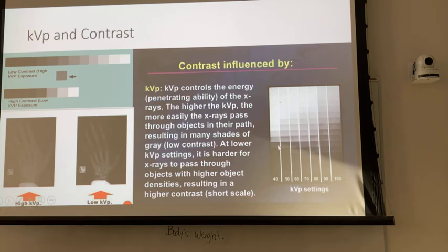So short grayscale, right? Short grayscale would be high contrast, low latitude. Long grayscale would be low contrast, high latitude, right?